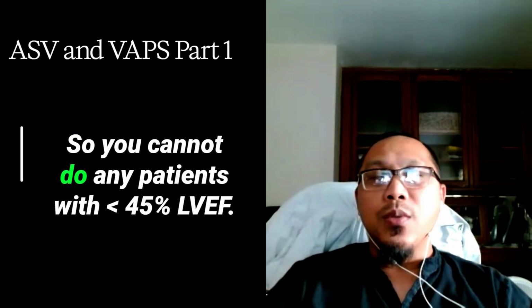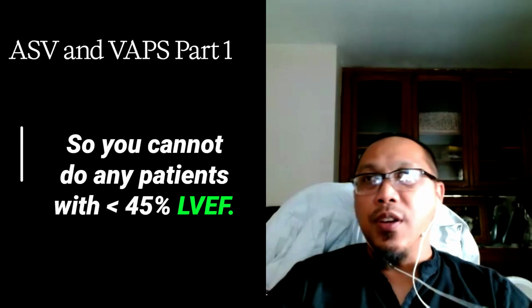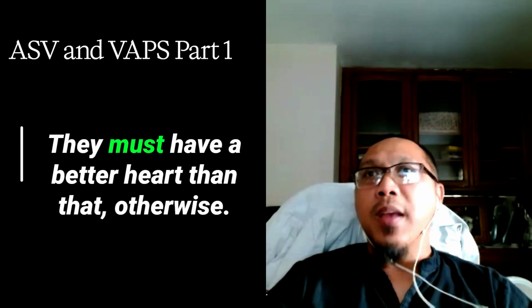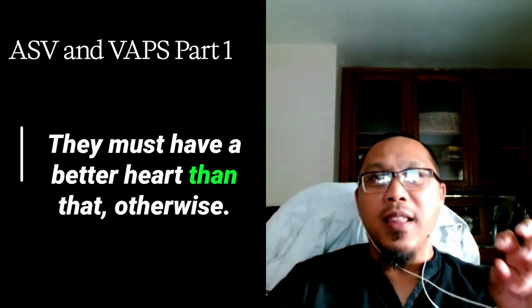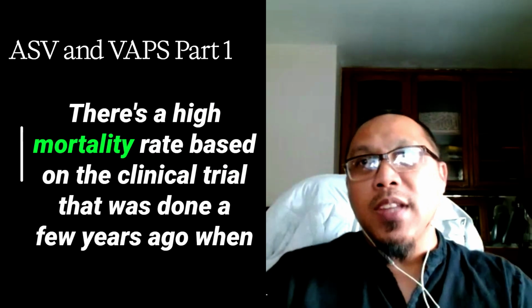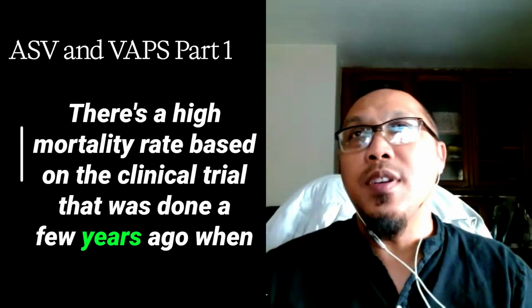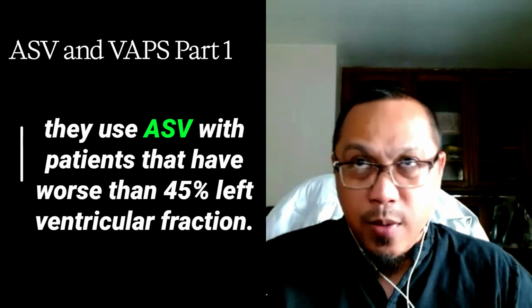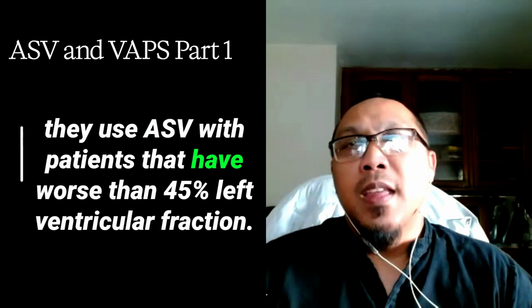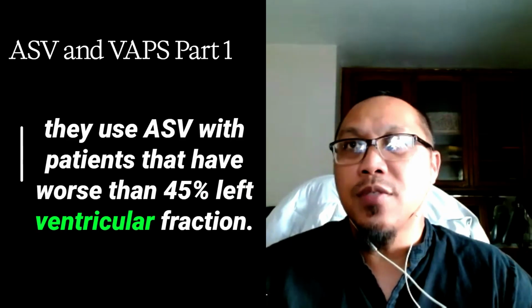So you cannot do any patients with less than 45% left ventricular ejection fraction. They must have a better heart than that. Otherwise, yeah, you can get sued. There's a high mortality rate based on the clinical trial that was done a few years ago when they used ASV with patients that have worse than 45% left ventricular ejection fraction.